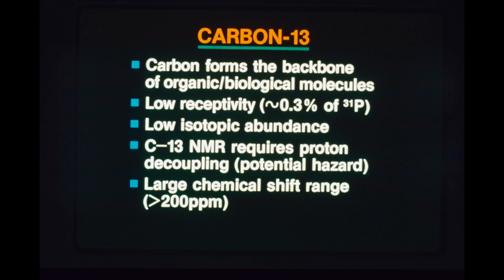And in some cases, if you want to isolate a particular carbon resonance, you have to decouple it from protons that are bound to the carbon-13. This can create a potential hazard. Essentially, you can cook your patient or the sample that you're looking at. So this is something that is a concern. The chemical shift range, however, is quite large. It's greater than 200 parts per million, and this can be used very well.